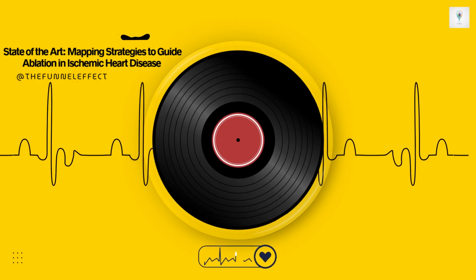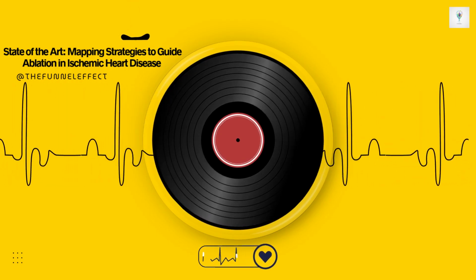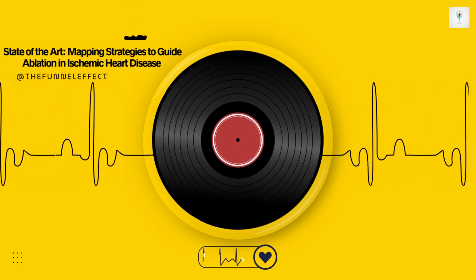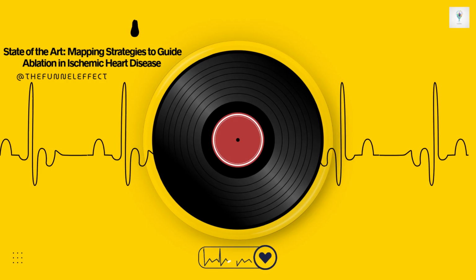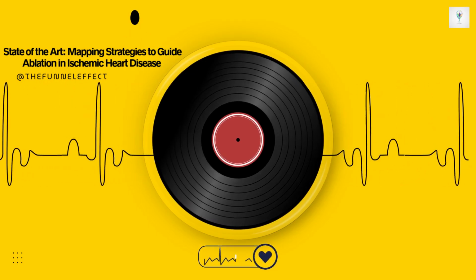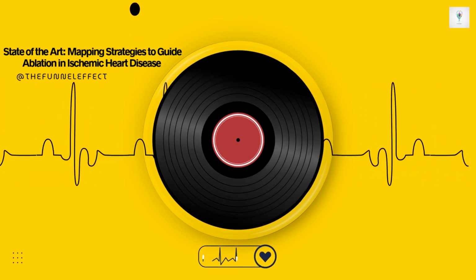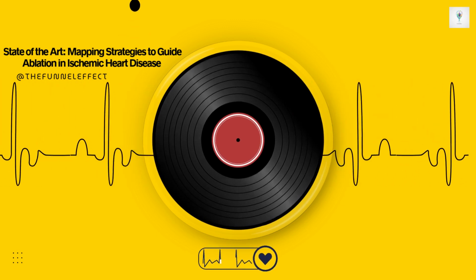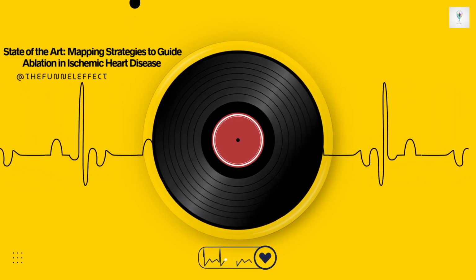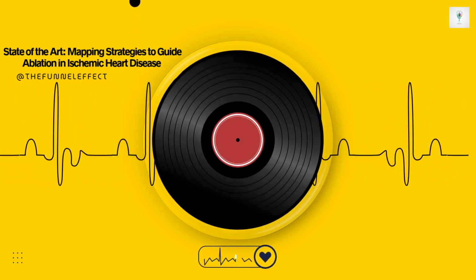Modern systems are incredibly fast, often using multi-electrode catheters that can record from dozens or even hundreds of sites simultaneously. This allows for rapid data acquisition. But even with great technology, you hit the timing challenge. Remember how we talked about those fractionated, messy electrograms in scar tissue? During VT, they can be even more complex. It becomes extremely difficult to determine for each recording site which specific deflection on that messy signal represents the true local activation time.